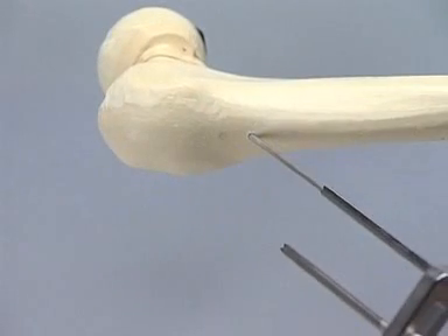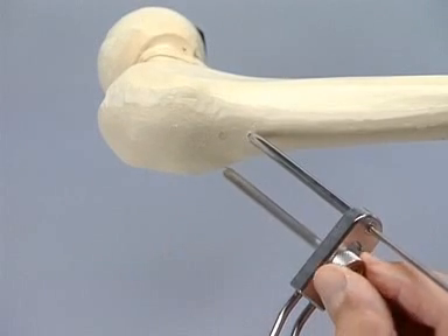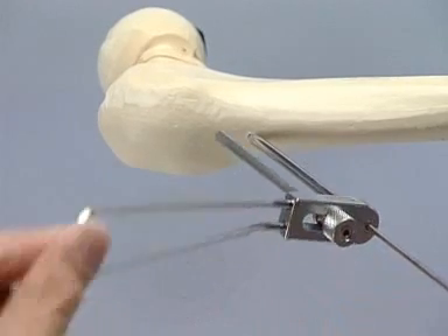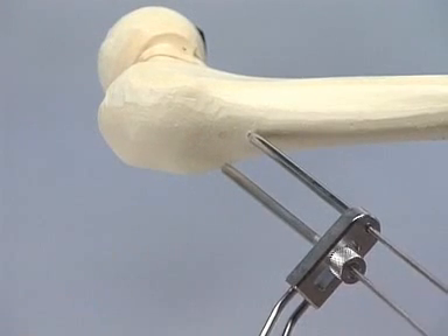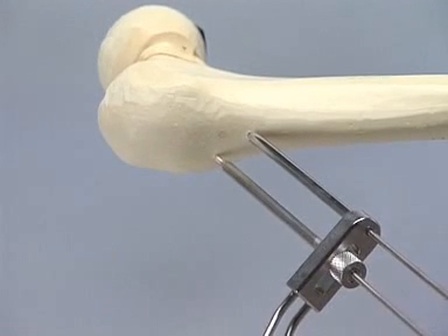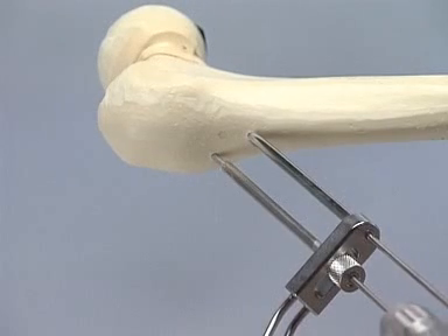We now use the new parallel wire guide. The movable sleeve may be locked at a certain distance and rotated around the first wire, always remaining parallel to it. We now introduce the second and third guide wire in the desired position. The reduction and placement of the guide wires is once more checked with fluoroscopy in two planes.